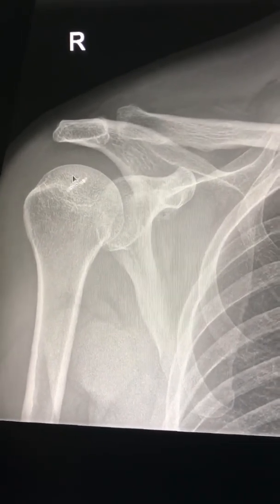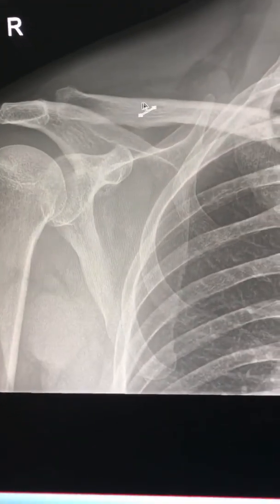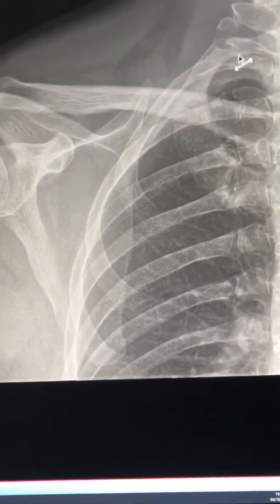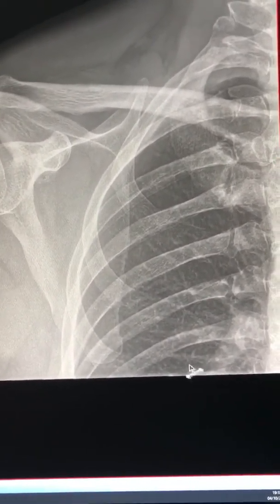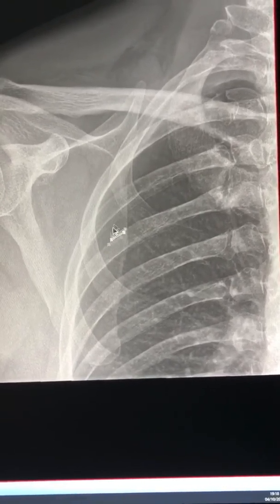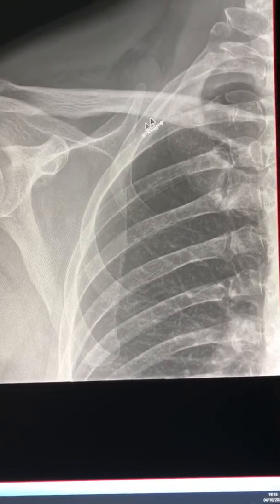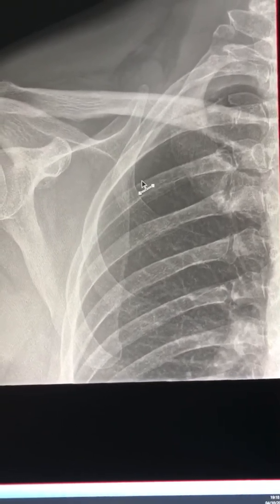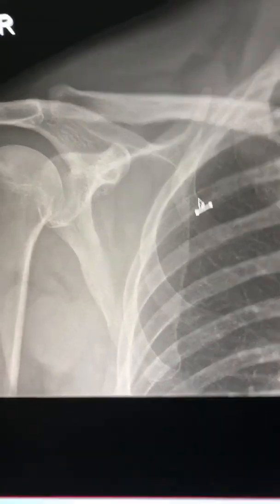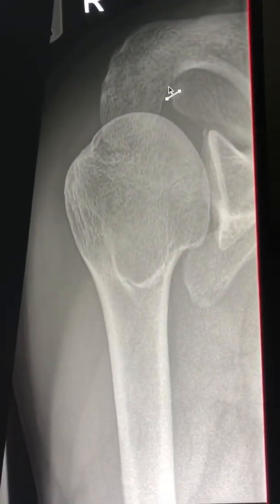After seeing the shoulder, look at the soft tissues around it, then look at the clavicle for any fracture. Go medially and make sure the lungs are clear with no large mass. Look for rib fractures and any pneumothorax, which is very easily missed and very commonly associated with shoulder or rib injuries.